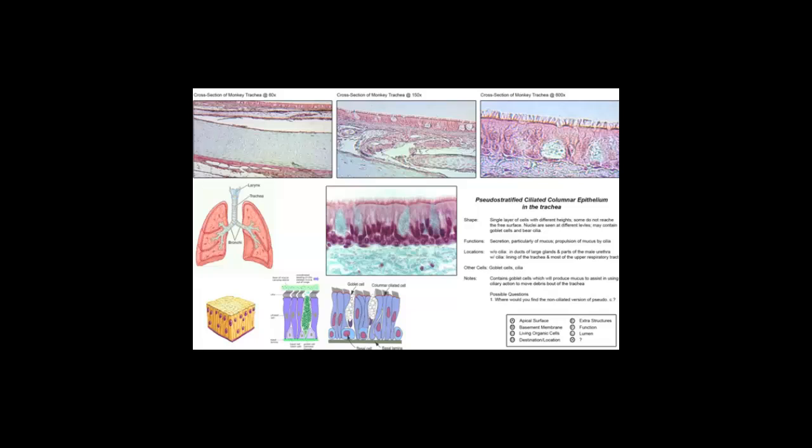Here's the submucosal area that has a great amount of arteries, veins, and lymphatic ducts of glands. We have the layer of hyaline cartilage that forms the C-shaped rings seen here in the airway that is our trachea. Those cartilaginous pieces would continue all the way into the tertiary bronchi, or the third level of branching here, and those would become bronchioles, would lose the cartilage and would increase smooth muscle to reinforce that airway to the point of alveoli in the transition.